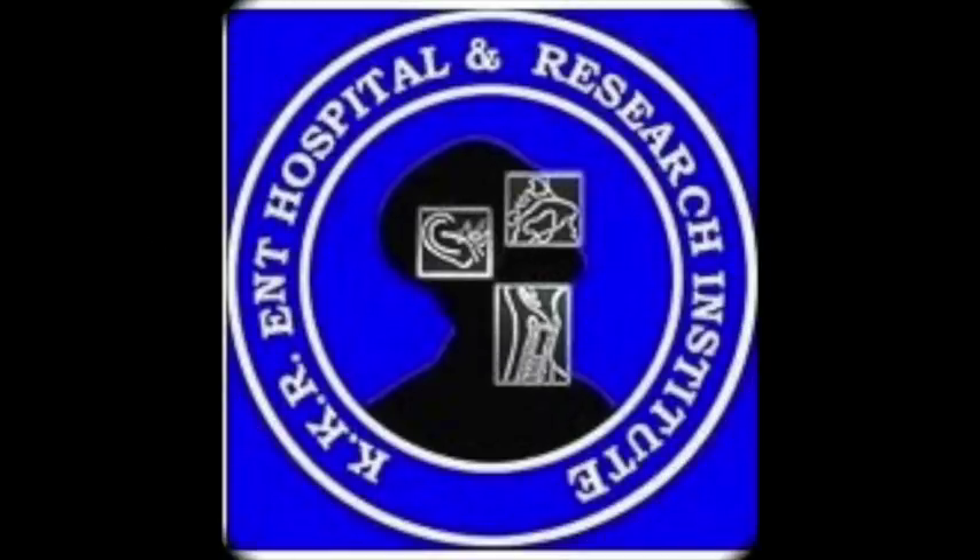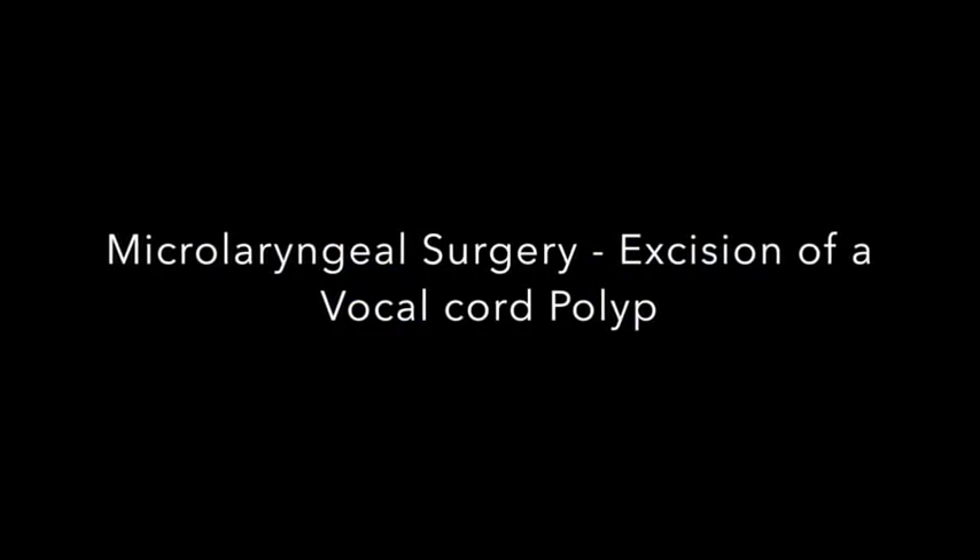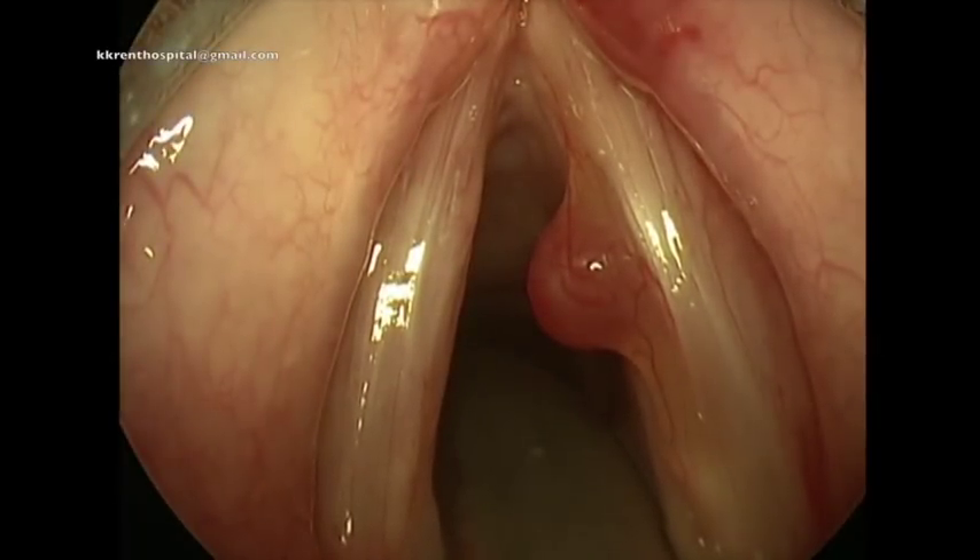In this video clip, I will show you the procedure of simple excision of a vocal cord polyp.